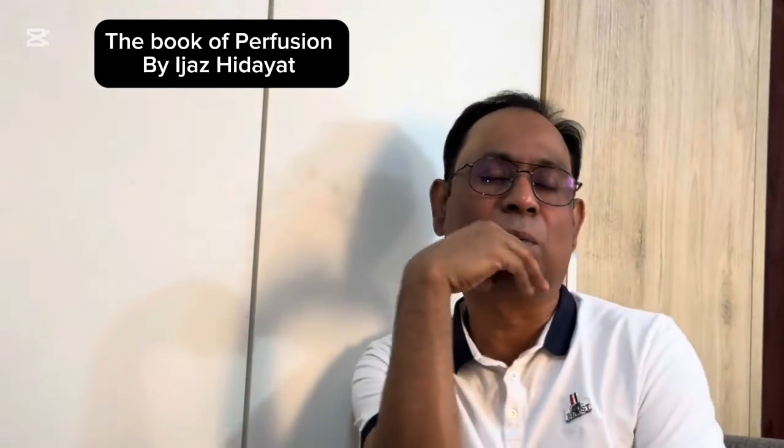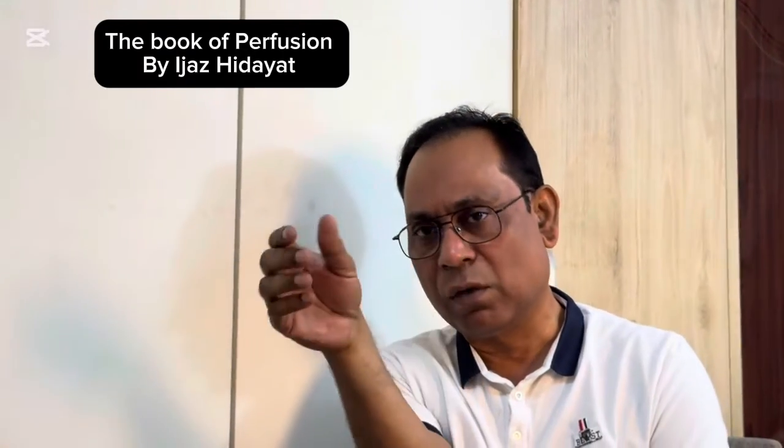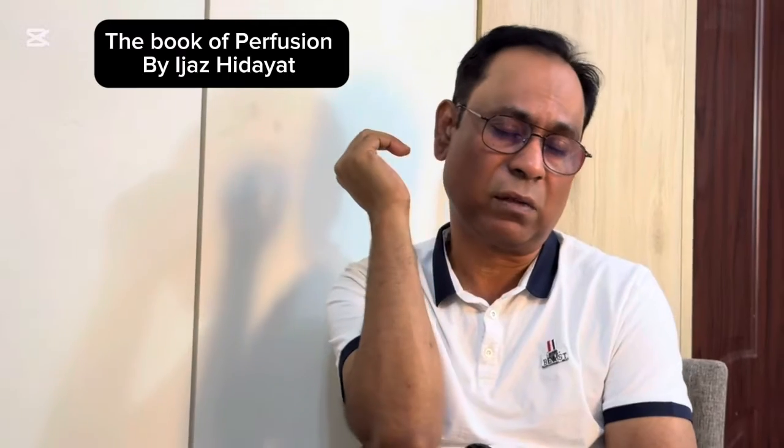This is the surgeon's preference for cannulation. In a case like a mitral valve with Marfan syndrome where the aortic root is still okay to cannulate, you can do central cannulation. But mostly if the patient comes for a Bentall procedure, aortic dissection or aortic aneurysm, and the brachiocephalic artery is involved in the dissection or aneurysm, then you have to cannulate the axillary artery or the femoral artery. Then you can open the sternum with the blood conservation technique, the blood salvage techniques. So keep the cell saver ready.